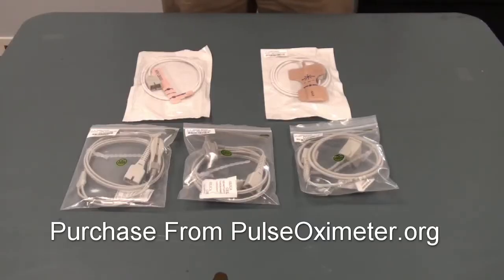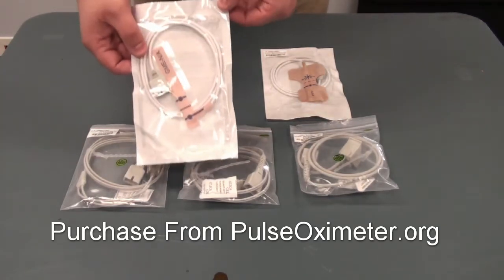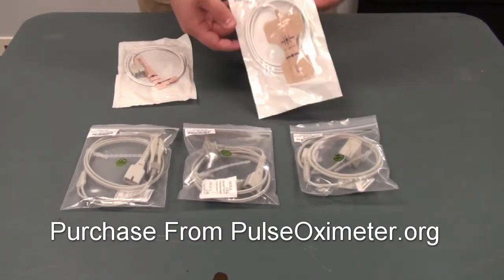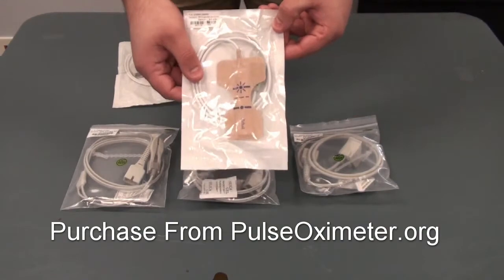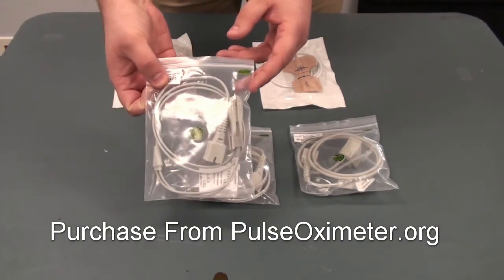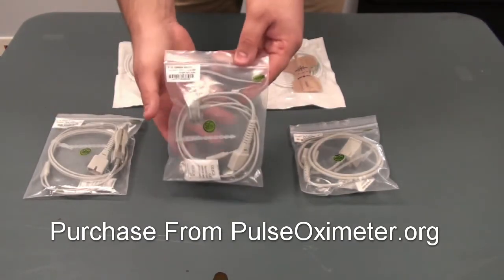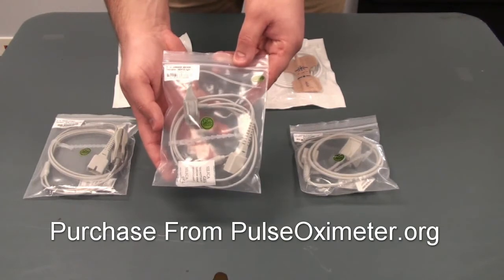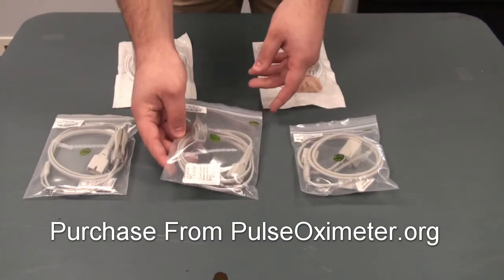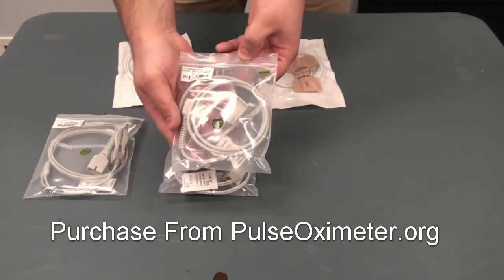Also available for this device are other probes. There's a child disposable, an adult disposable, an ear clip probe, a wrap probe that can go around a finger or a toe if necessary, and on special request, a fingertip probe.